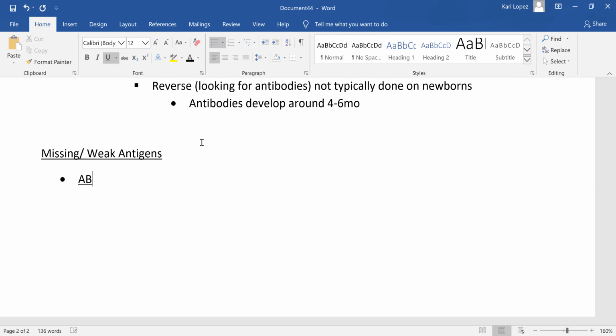So you can have ABO subgroups. And you repeat with anti-AB or anti-A1.